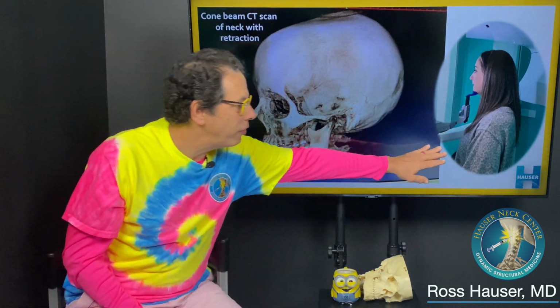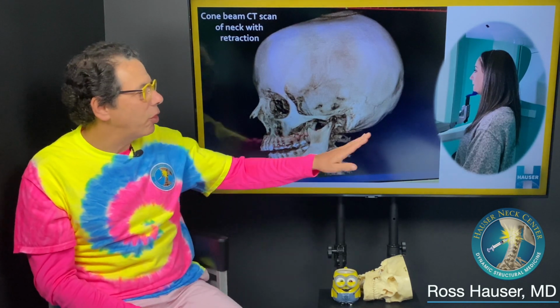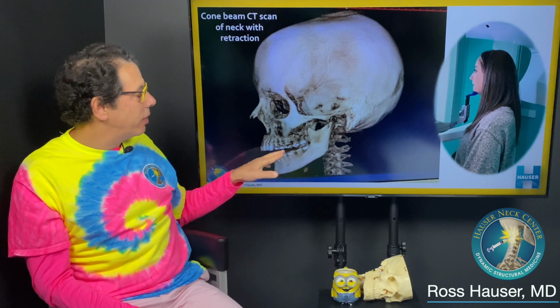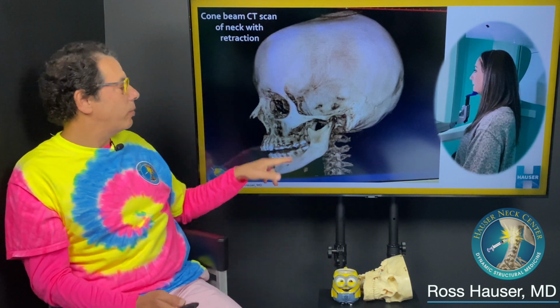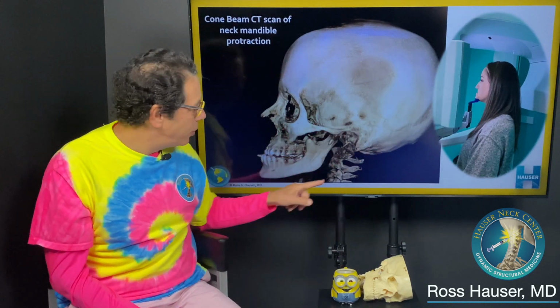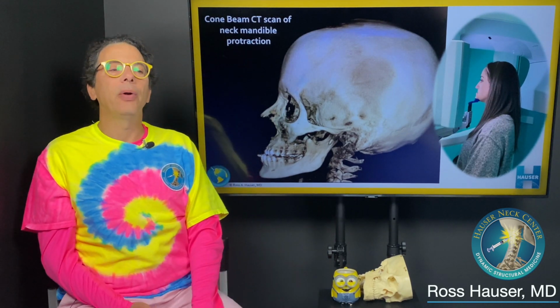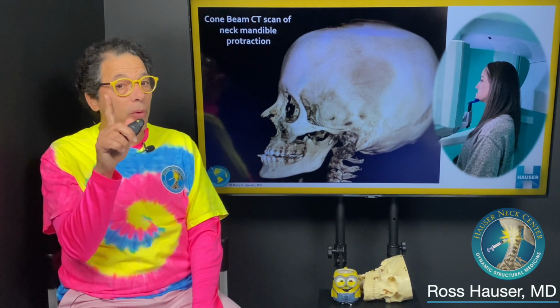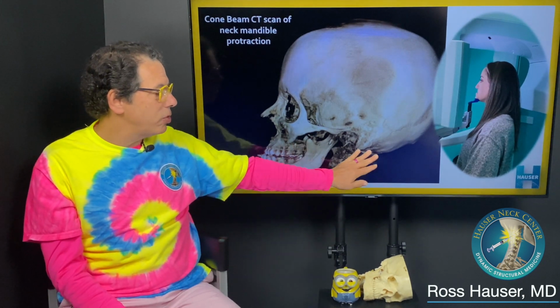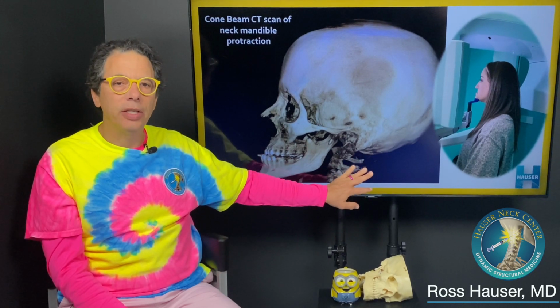And again, this is Izzy, who does the filming here. She's behind the camera today. What I wanted to show you is how sensitive this is, and all I had Izzy do was change the configuration of her jaw. So this is with retraction, that's with protraction. You could see how her jaw is protracted out. In another video, we'll show how Izzy's jaw motion, just the jaw motion, changed the configuration of her atlas and axis, C1 and C2.